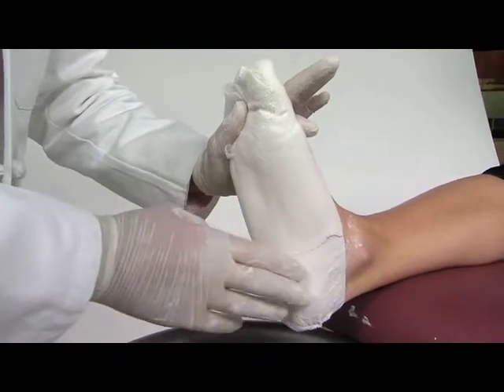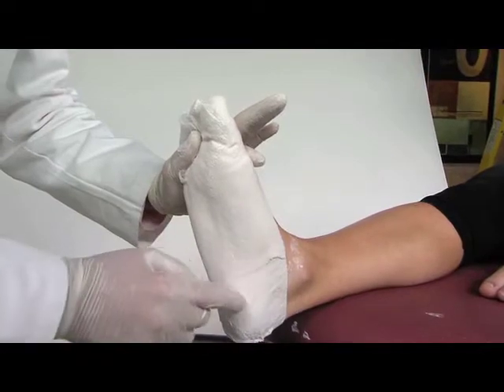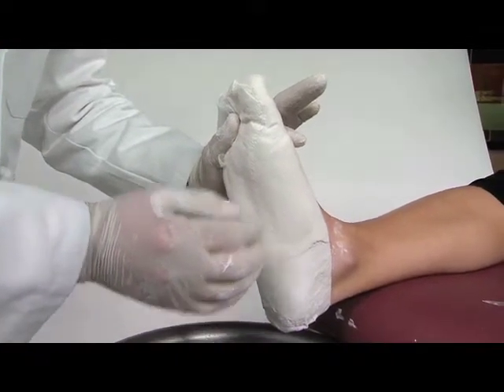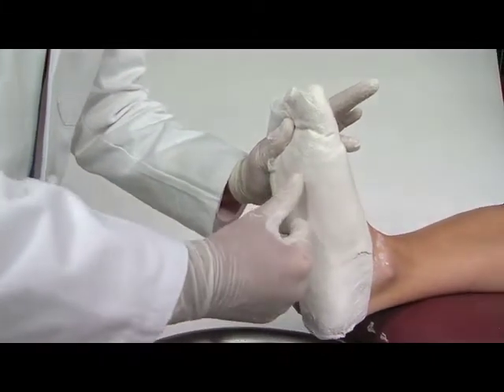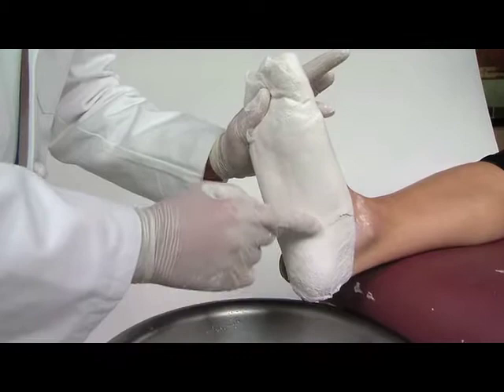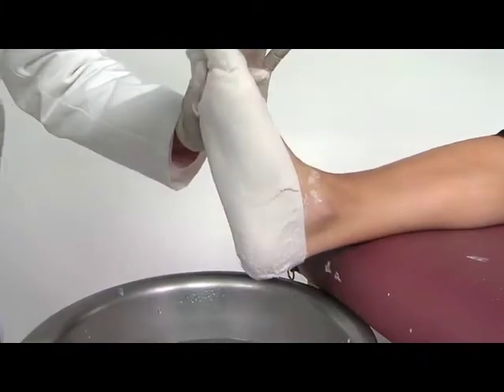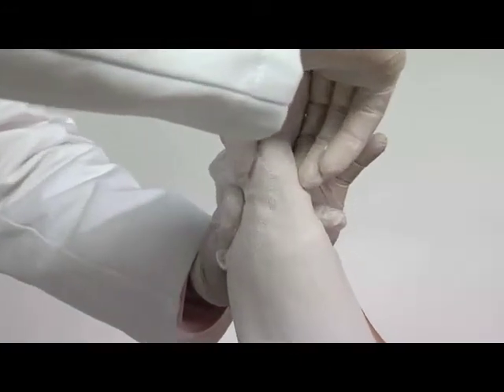I'm now looking again at her toes — they're all in alignment. Her hallux simulates as if she was standing on the ground: not plantarflexed, not dorsiflexed, at a nice angle relative to her first metatarsal head. Her medial arch nearly represents what we want, other than fat pad expansion from the orthotic. If you can imagine making the orthotic from this material, you want to hold the foot in the exact position you want it held by the orthotic we fabricate at the laboratory — the lateral column is nice and straight, a little bit of lateral arch, a little bit of metatarsal arch, and a medial longitudinal arch — not pronated, but in a nice neutral position. The talonavicular joint is neutral, the subtalar joint is neutral, the toes are all in alignment, and the hallux is neither dorsiflexed nor plantarflexed, simulating standing on a flat surface.